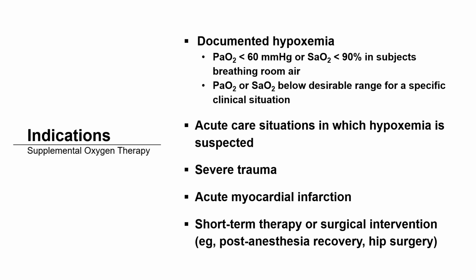specific clinical situation. It's also recommended for acute care situations in which hypoxemia is suspected, severe trauma, acute MI, short-term therapy in the recovery period after anesthesia, and surgical interventions like hip surgery.